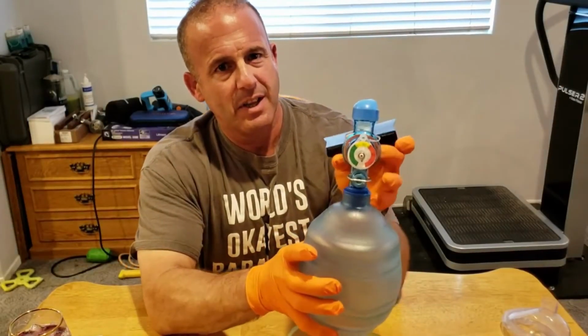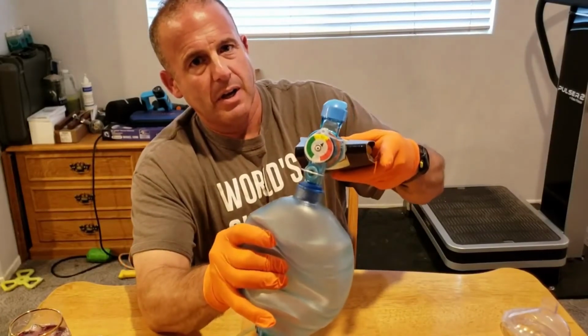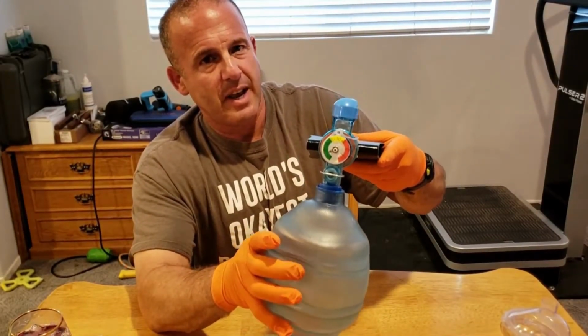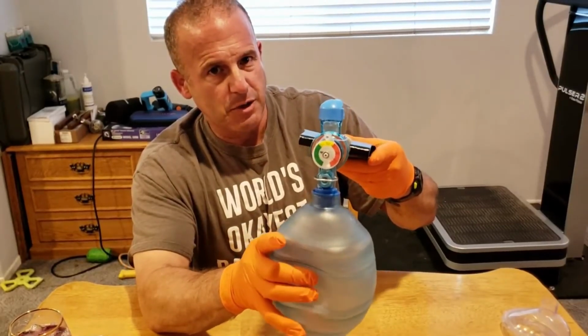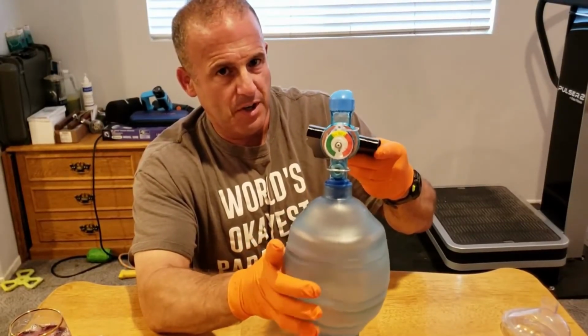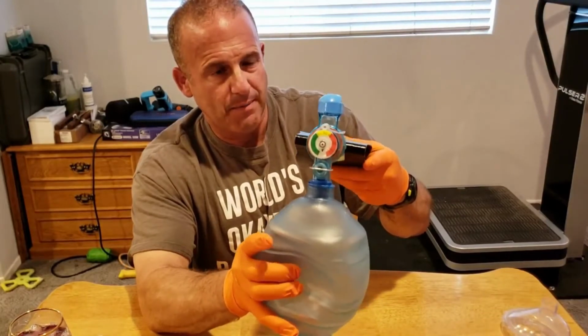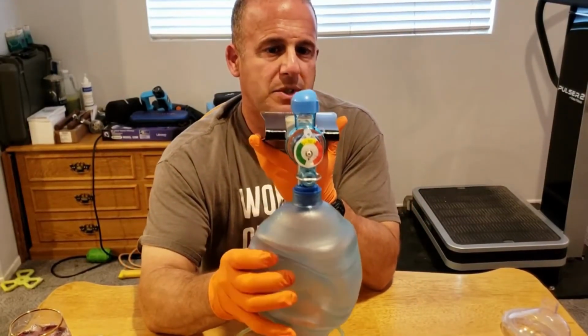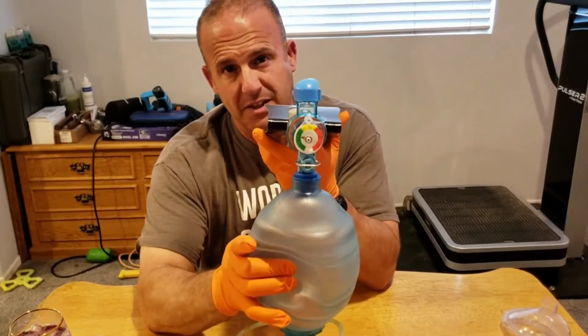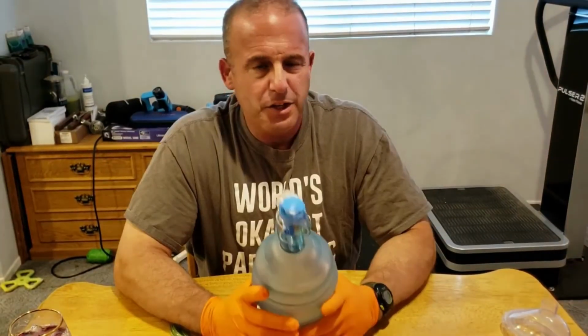If for some reason that pressure goes up, then that tells me that I have an obstructed airway issue and I need to either reposition the patient, suction, and otherwise troubleshoot the problem. A person with a patent airway will have very little resistance, and in my experience, even less than this artificial lung.